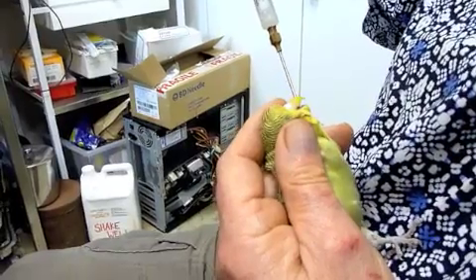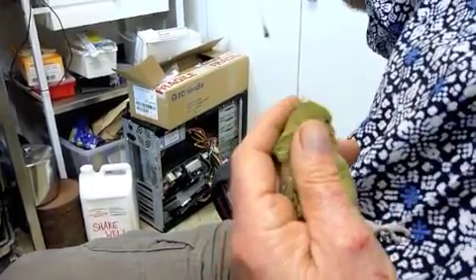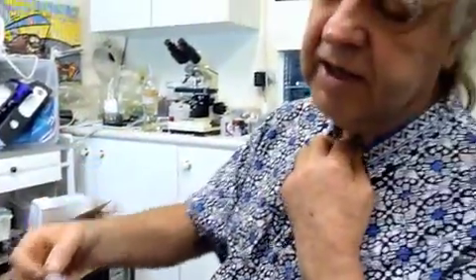We're getting some goo back out of her throat, so we can now take the tube out. At this stage, rather than just dumping her back in the cage — if you couldn't care less — it's a good time for some TLC again.